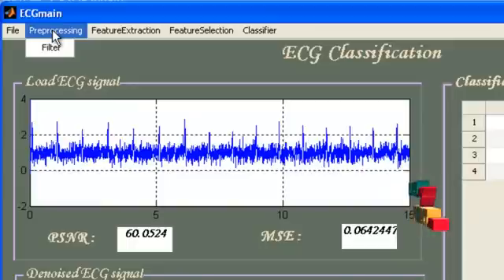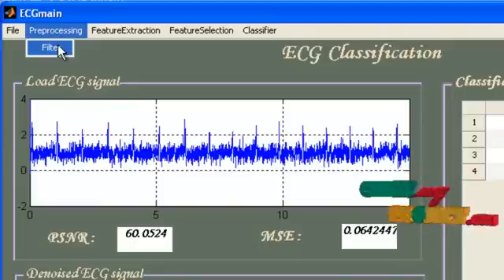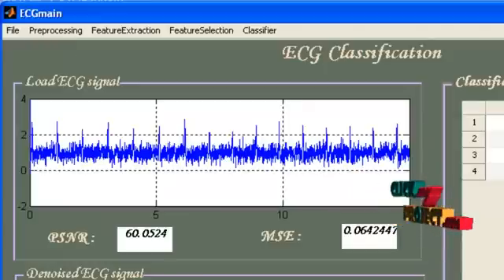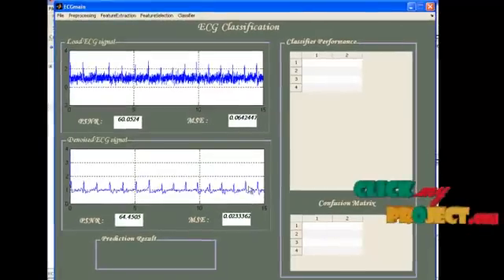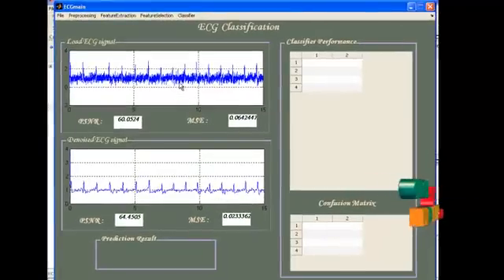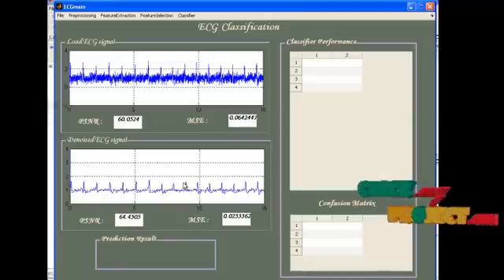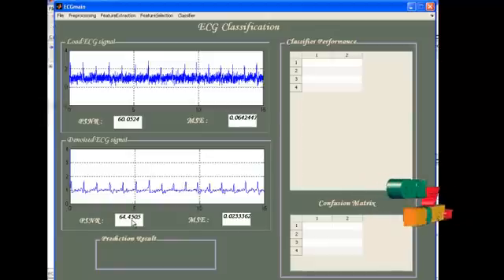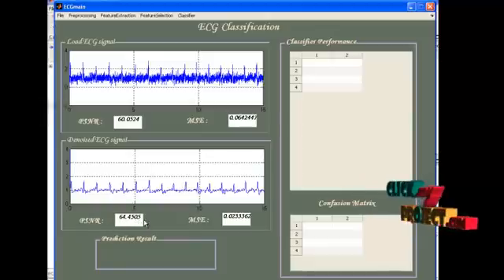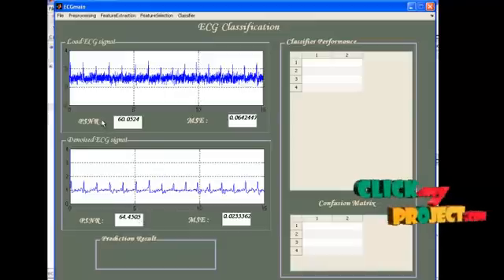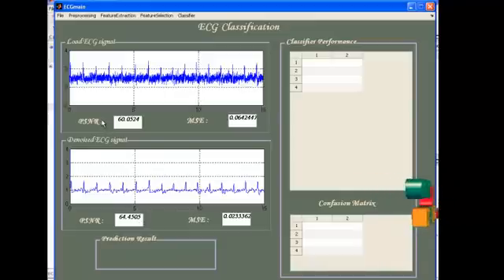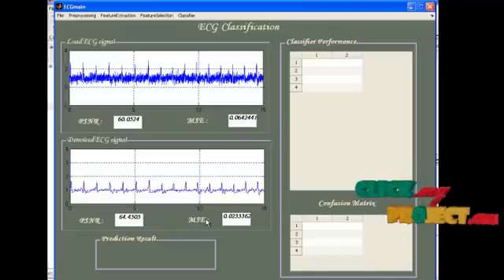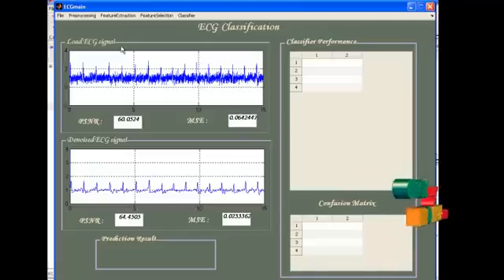Now, I am doing the filter. Under preprocessing, select filter. The filtered ECG signal will be displayed. Now, you can see the difference between the input noisy ECG signal and the filtered ECG signal. See the PSNR value, now it is 64.4505. It is much better than the original PSNR computed for the input ECG signal. And the mean square error is also reduced.